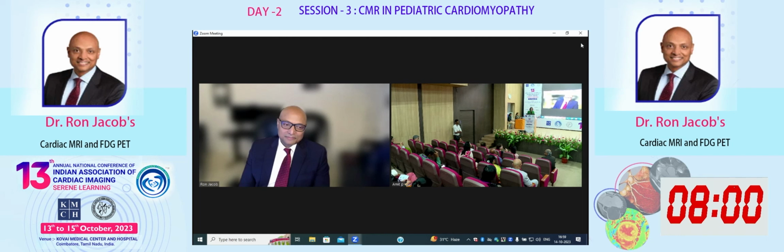That's crazy. So now when we upgrade the software or something happens to the scanner, I might stick the phantom in there and scan it, and then we analyze it. Did it pass or fail again? If it passed, then I'm reasonably confident that it's working okay. So that's sort of how we approach this.